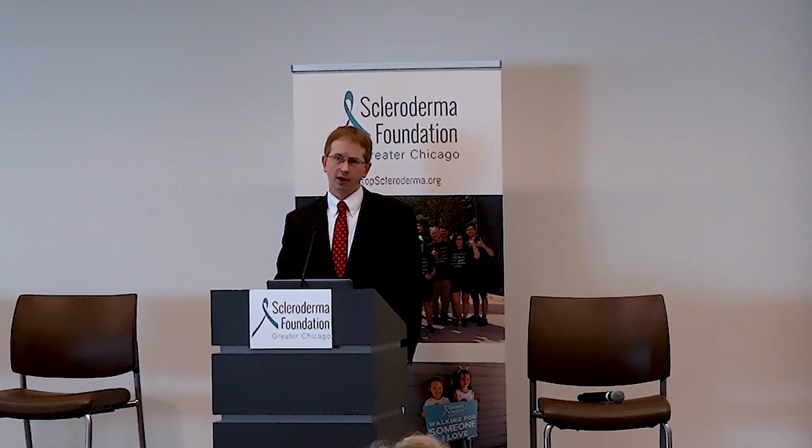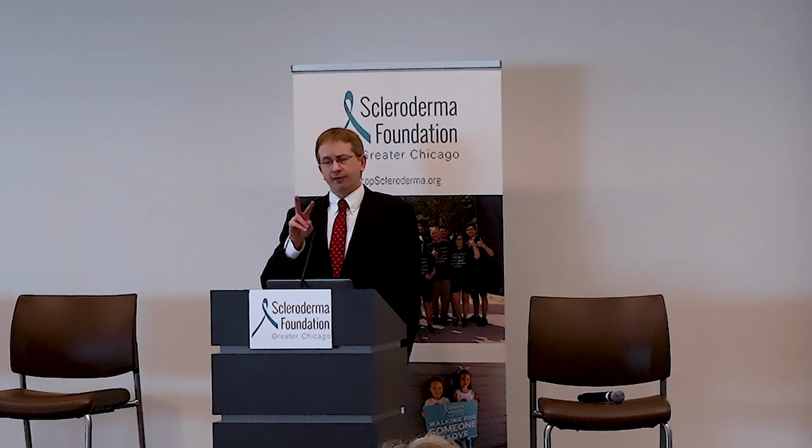There, canonically, we say that autoimmune arthritis, inflammatory arthritis, is thought of as relatively uncommon in scleroderma. But one point I wanted to emphasize today is I think that is underdiagnosed. People say 5% of patients have it. Well, there's a couple studies that have used ultrasound to assess this question, and there's this first study here in 2012. Clinically, the rheumatologists at this center thought that 15% of their patients had inflammatory arthritis, synovitis, that swelling of that tissue that I showed you on that slide earlier.